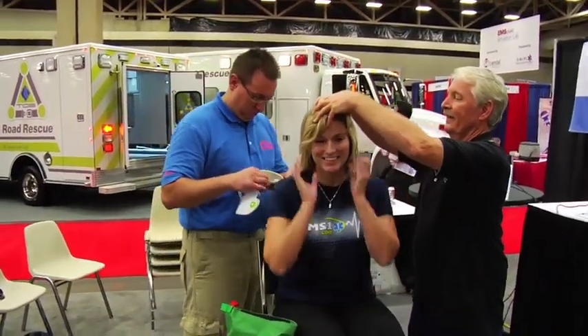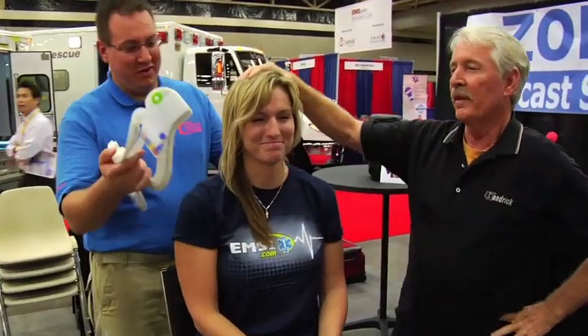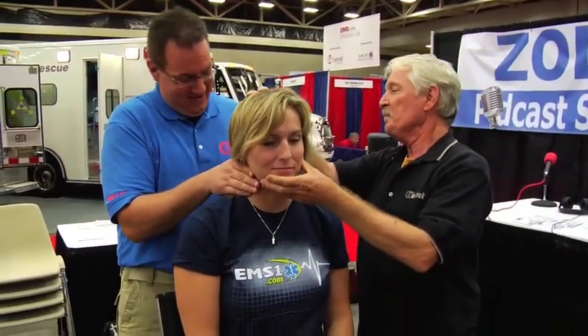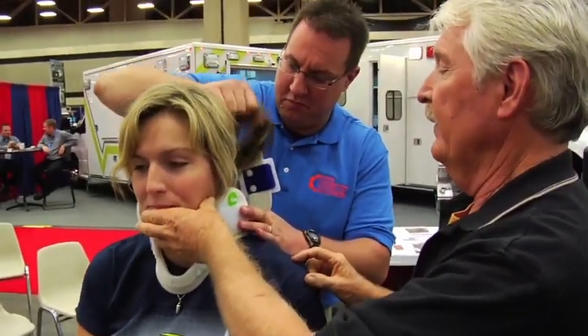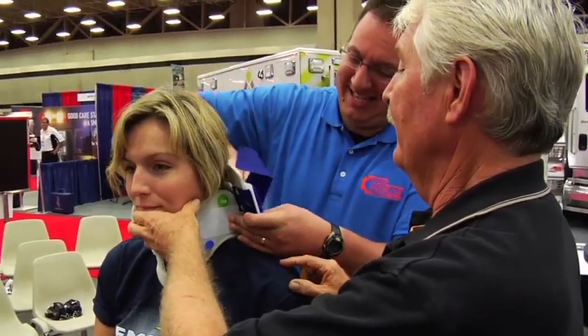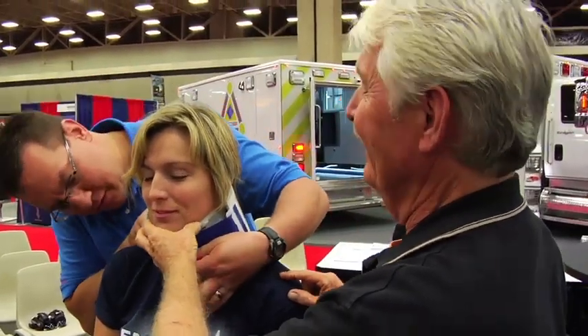Put the collar on her. In a normal procedure, my biggest caution that I give to people is that once you put the collar on, the person maintaining stability of the head and neck continues to hold their head and neck — you don't let go of it. But Jason, my assistant, I need him to do other things, so we're going to let Julie's head go. Keep in mind there is a rescuer there holding onto the head.